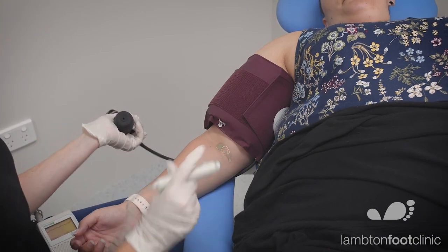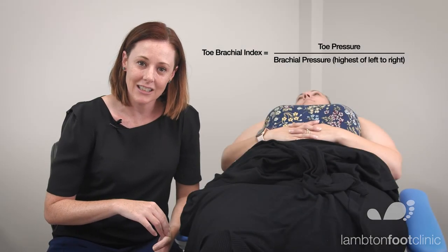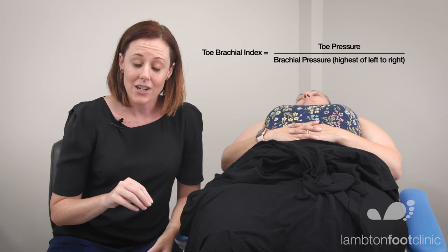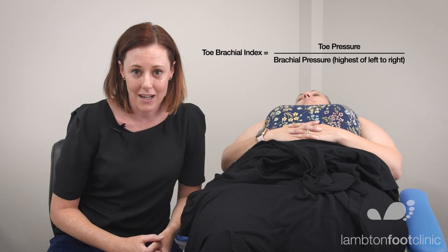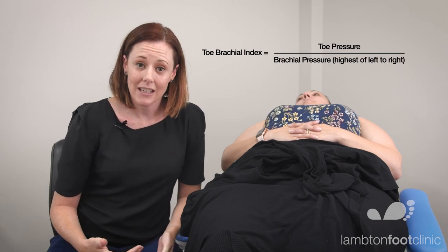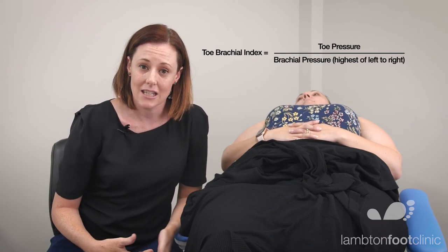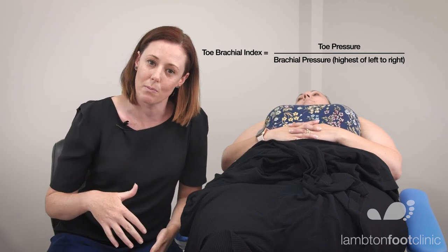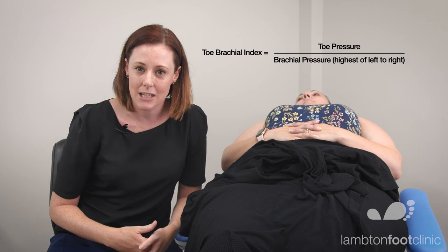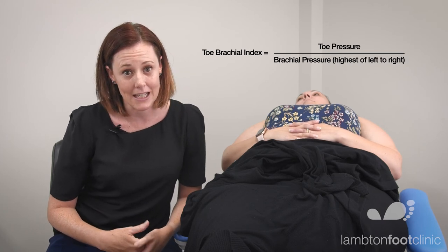That one. Lovely. So once we have our brachial pressure, we'll get our toe pressure and divide that into the brachial pressure, and that will give us the toe brachial index. The toe brachial index should be greater than or equal to 0.7. Once it falls below 0.7, we would consider that to be indicative of PAD.